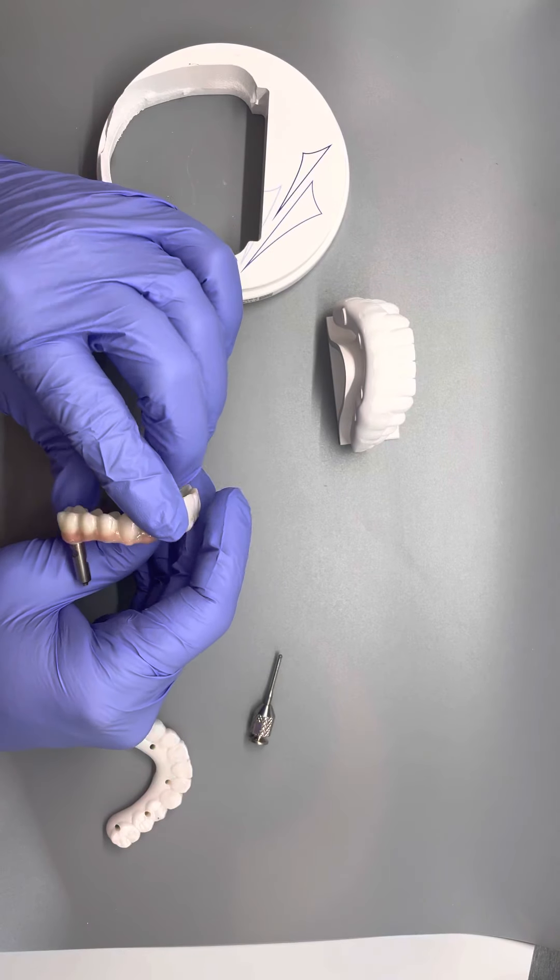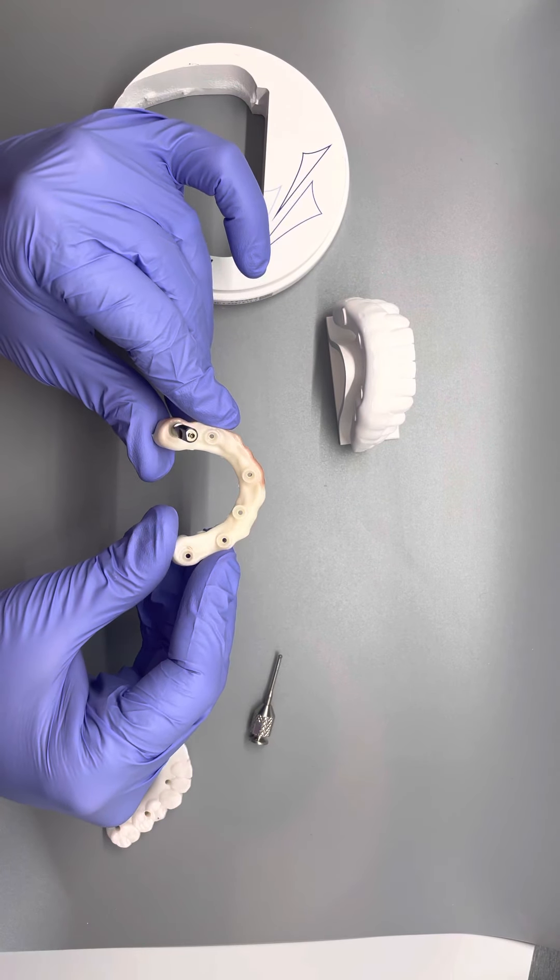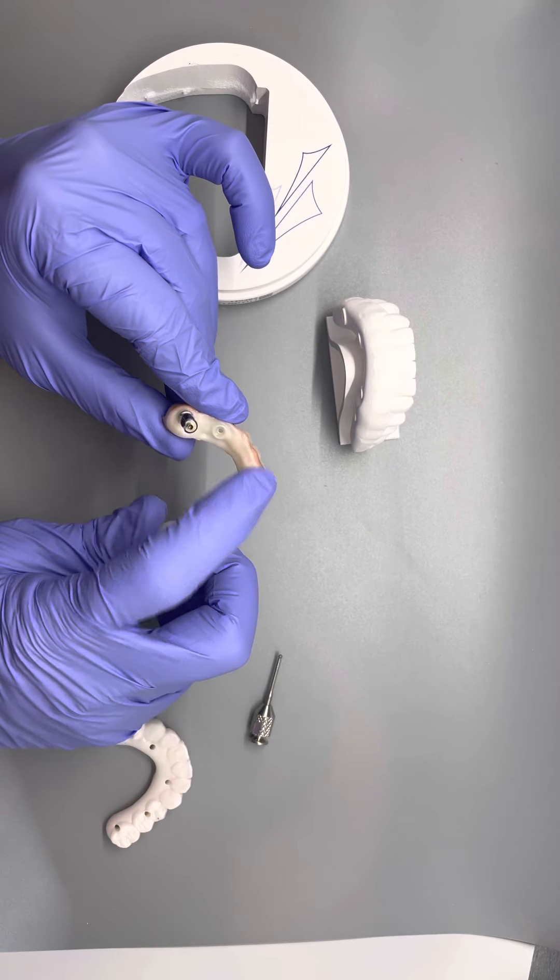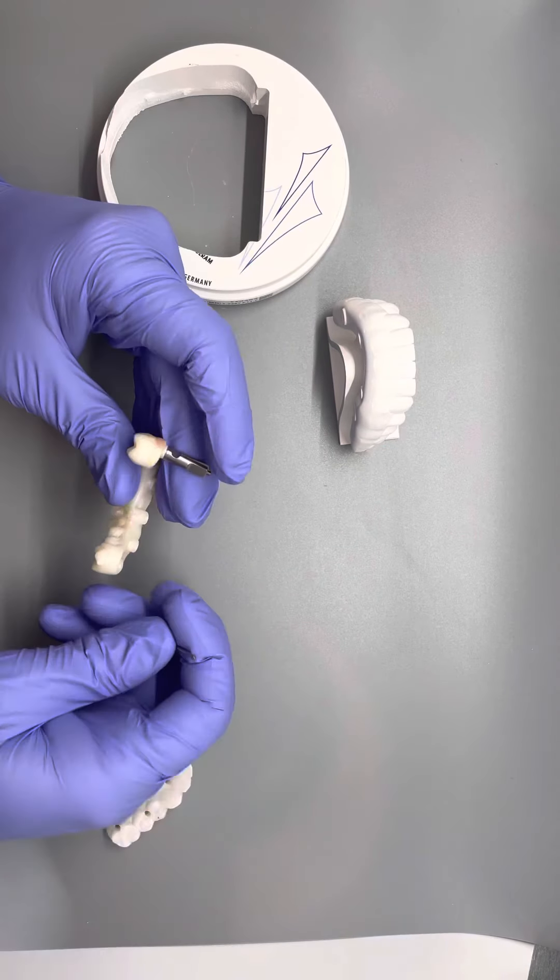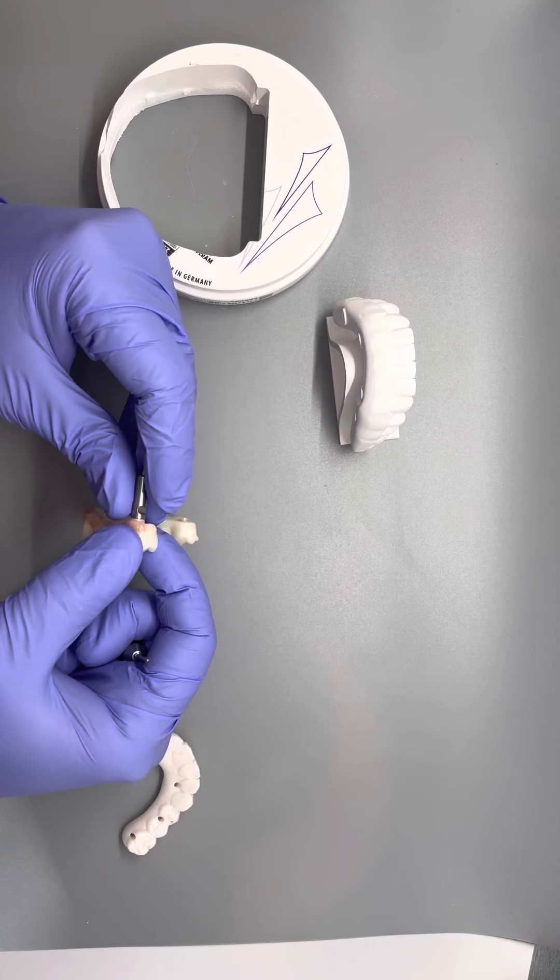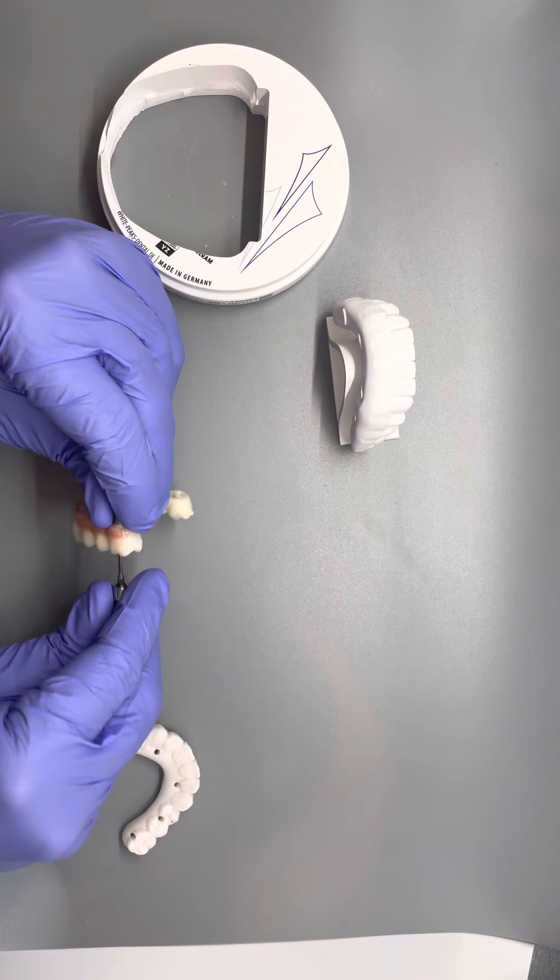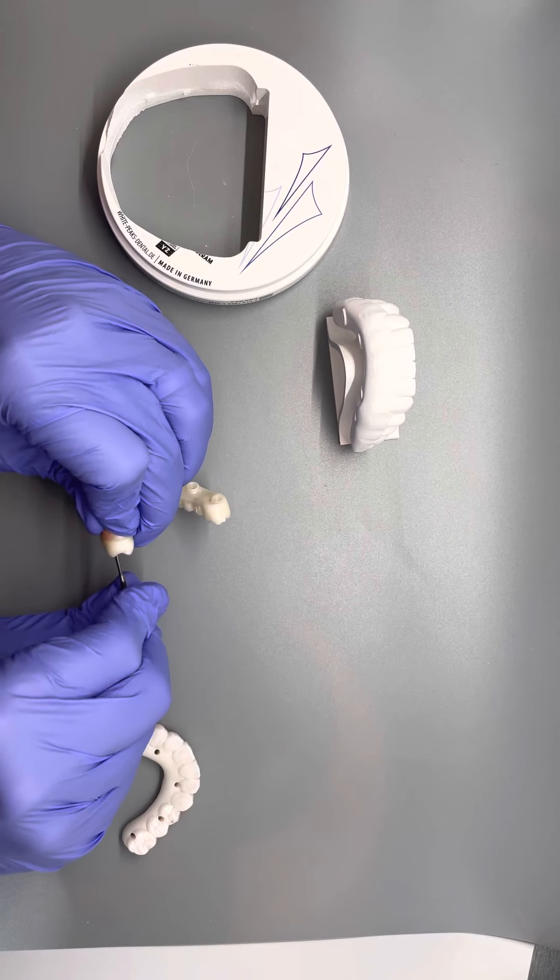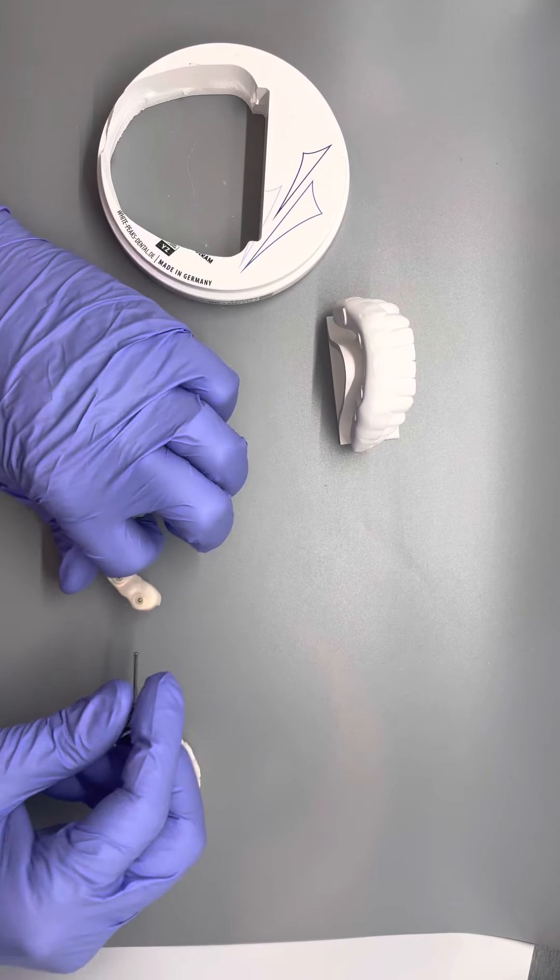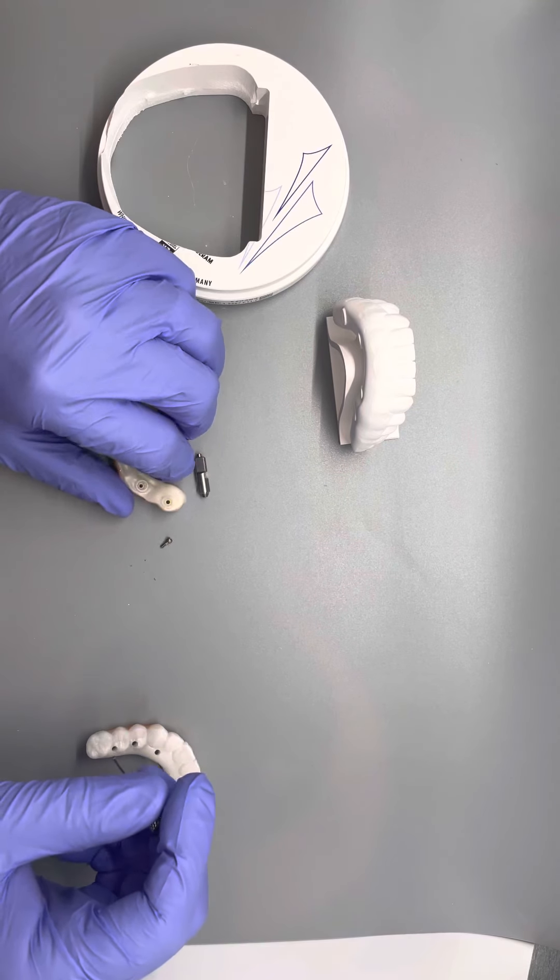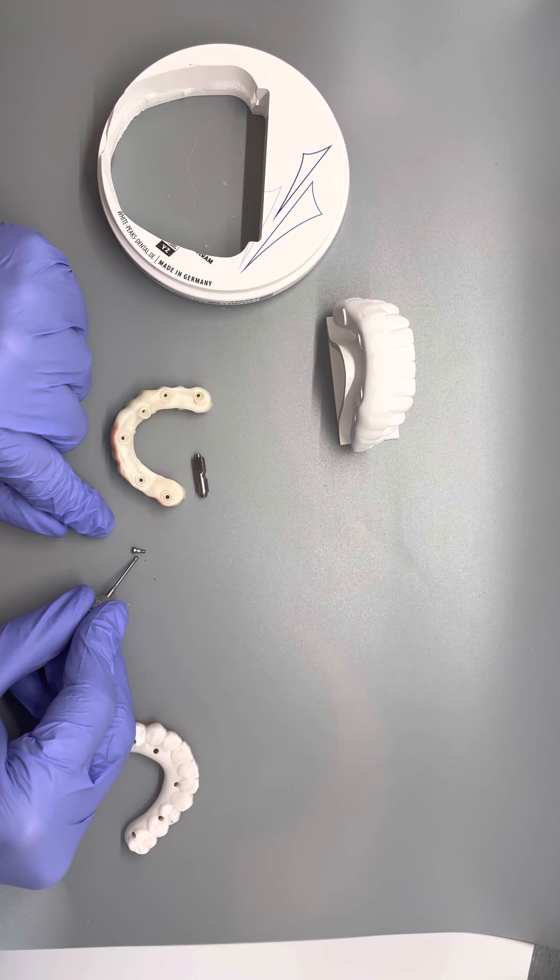And so this is just showing how we have on this patient we had six implants and how that screws down into the implant. This is not an implant. It's just an analog showing how that would work. But this is how we would screw in the screw denture. It's just this little screw right here. It's very strong.